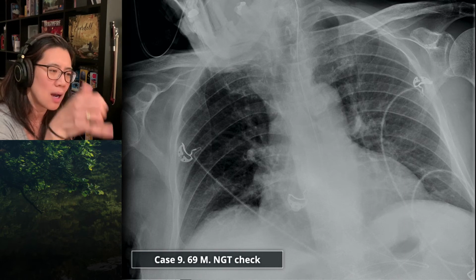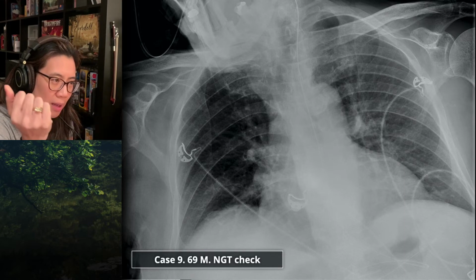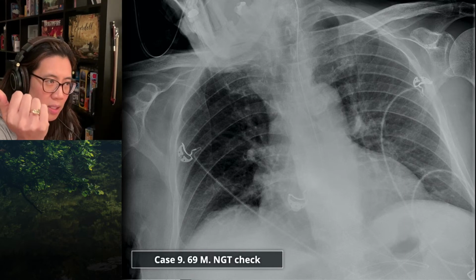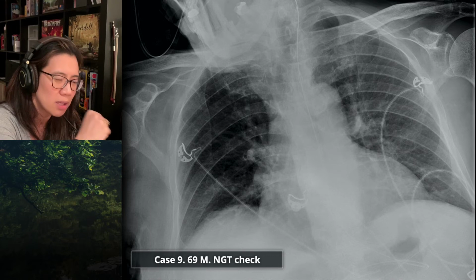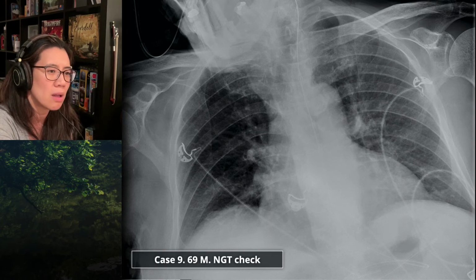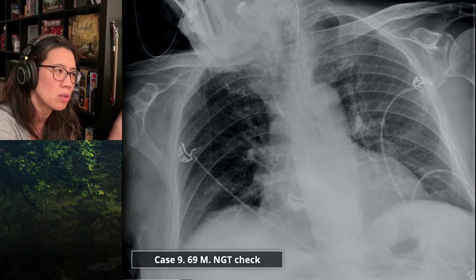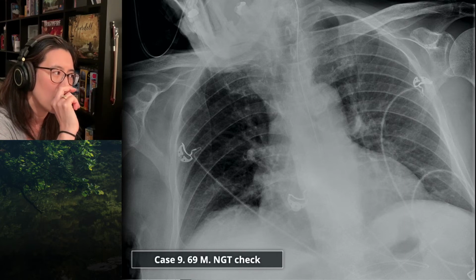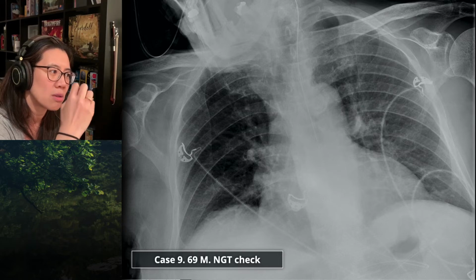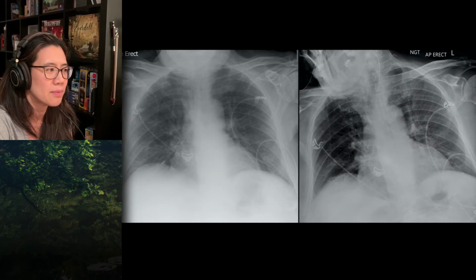The heart size and cardiomediastinal contours look within normal limits for an AP erect film, and there might be some minor blunting of the right costophrenic angle, no pneumothorax. So the question is whether the increased density, the asymmetry in density, is due to the rotation of the patient, which is what I'd be postulating as a potential first port of call. Good. Excellent. Go to the next slide.